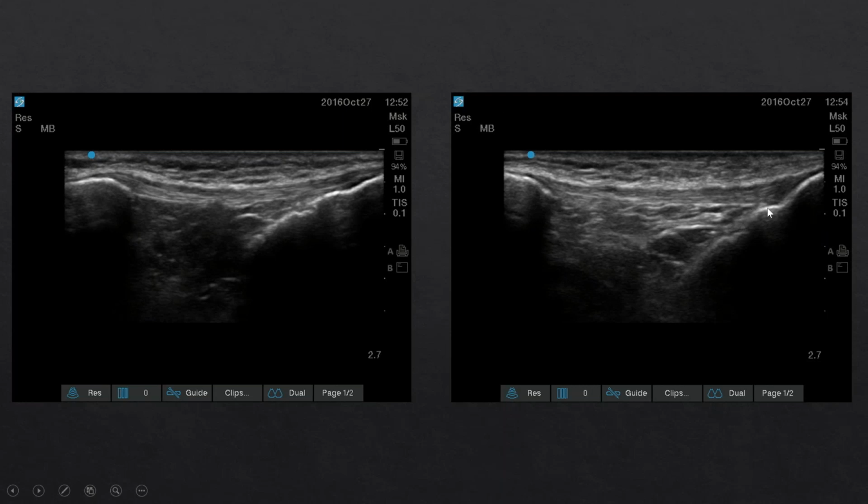So look at the distal end of the tendon. It looks thickened and hypoechoic, and it looks non-uniform. It doesn't have uniform thickness, and it looks abnormal. Again, the reason is that we did not take the slack out of the tendon, and that's why you get hypoechoic abnormal signal there. And that's an artifact, not true pathology.